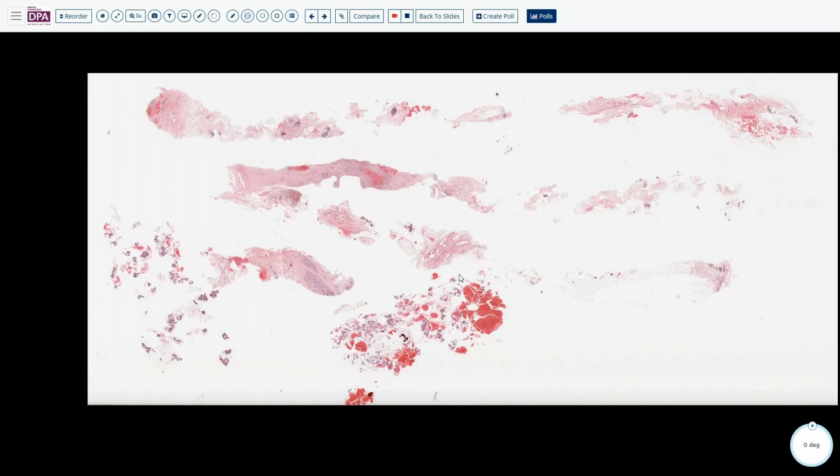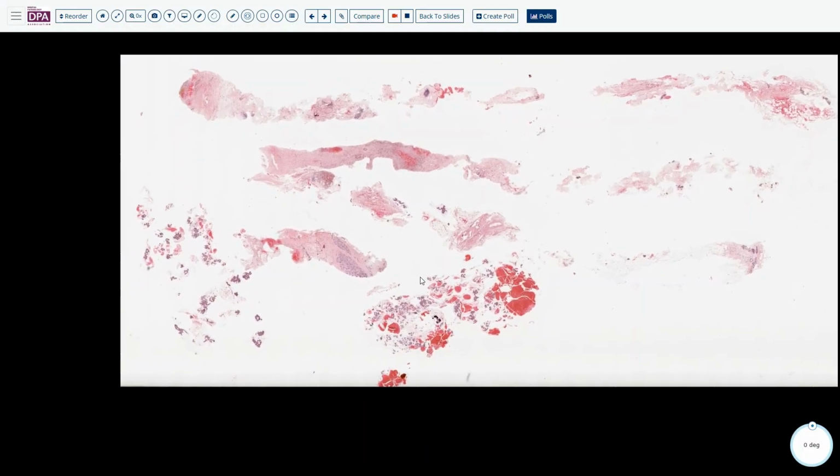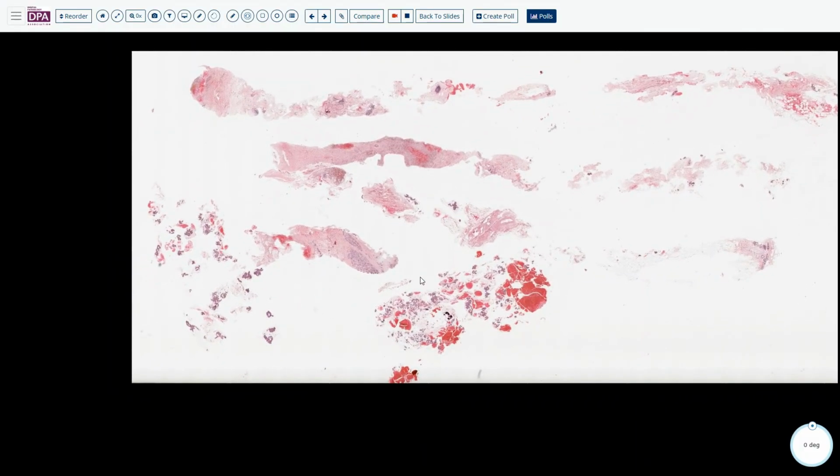Okay, we have the last two cases. All of these are easy. Anyone want to take one? Or I can just go through it.